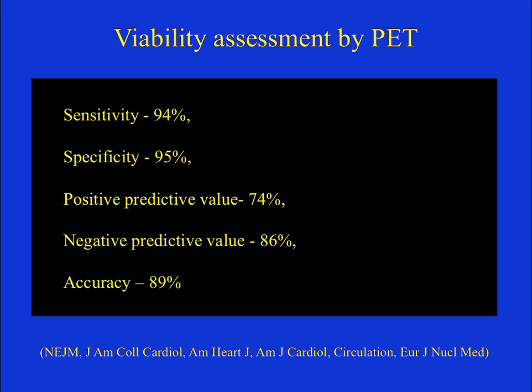PET has a very high accuracy in predicting myocardial viability, with a reported value of 90% accuracy, sensitivity of 94%, specificity of 95%, and pretty high predictive values.